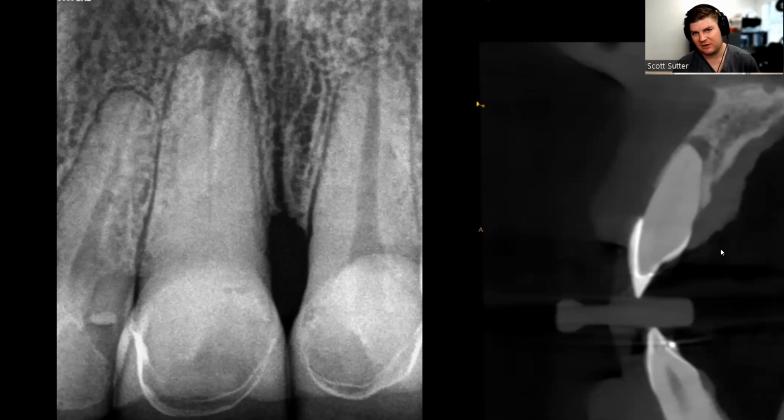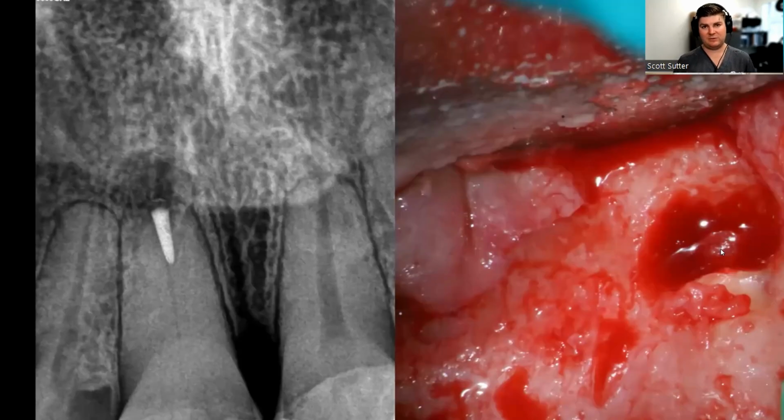And so I talked with her about, hey, your veneers could break. This is definitely going to be a complication here. And she didn't want to do that. So what we did was just do the apicoectomy. Flapped it back, cleaned it out, popped it inside there, and she has had no issues with this tooth since then. I don't have a recall. This is about a year ago. Like I said, she works about 2 hours away, but I called her and she's still feeling good. So kind of a cool option there as well. So I just wanted to throw in, you don't always have to drill a hole all the way down. There are some interesting things you can do, but I would recommend doing these on the right patient.